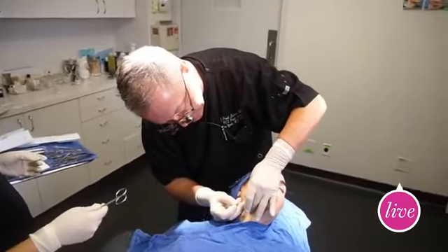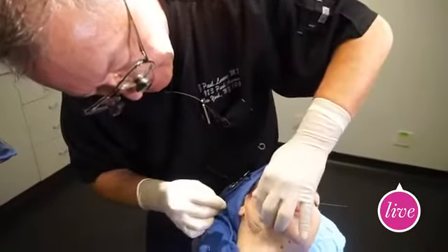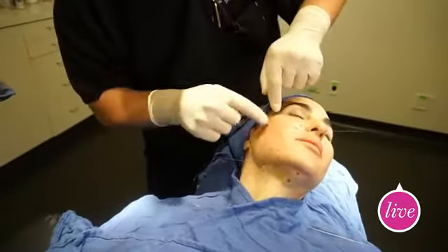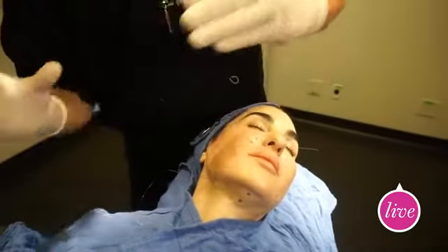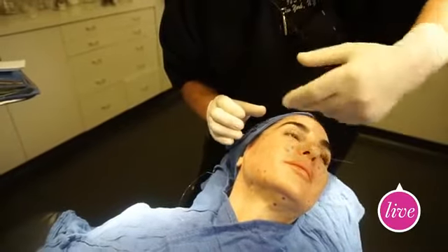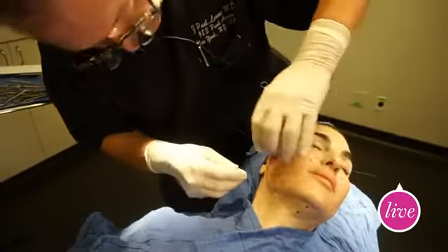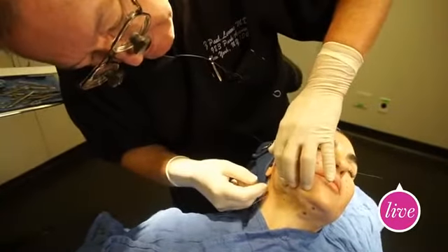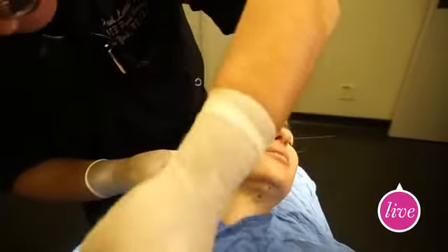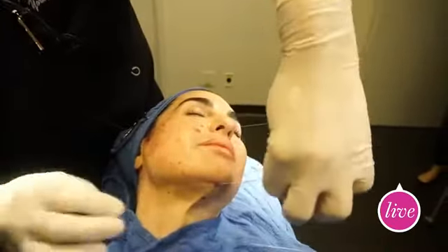So it's a bioabsorbable, completely absorbable device that has cones on each side, and the cones are oriented like this. We insert it into the middle of it, and then the cones are facing both ways. So these cones, the upper cones, act as an anchor, and I'll show you how I advance all of the tissue towards the anchor. So it lifts the tissue, completely absorbable device, minimally invasive, because as you can see, we're just doing it under local anesthesia. Patient's very comfortable, ambulatory obviously. Patients go home right away after the procedure.